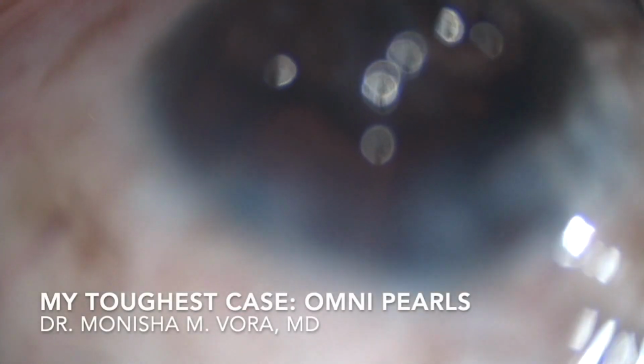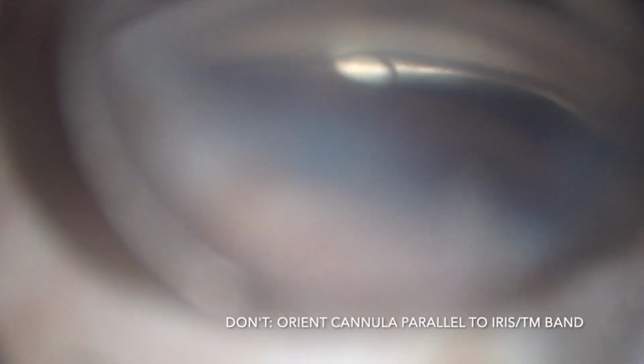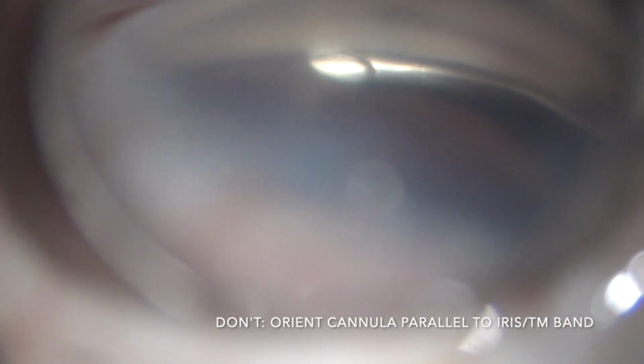And now I'd like to demonstrate a live case of my own, which I call my toughest case, that really highlights many pearls of how to use the Omni that I have learned over time. So the number one rule when performing MIGS surgery is to get an en-face view of the trabecular meshwork. Make sure to magnify yourself all the way up so that you have the view that you need. If you don't have the view, you're going to have a very difficult time performing the procedure.